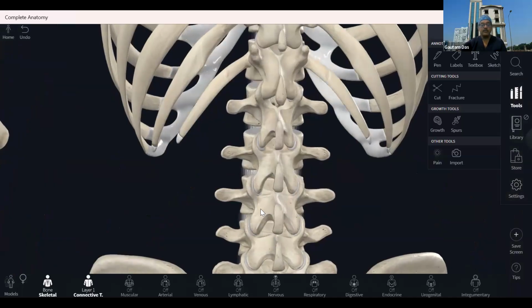In the lumbar area, normally you hold the probe first here, and then you'll be able to see the transverse process, short axis. If you hold the probe like this, in short axis, you'll see hyperechoic lines, and below that there will be acoustic shadow.